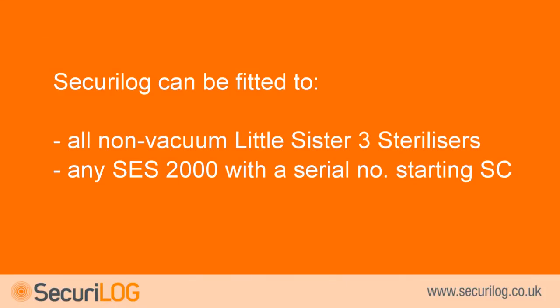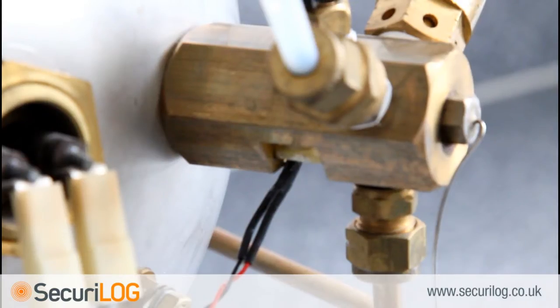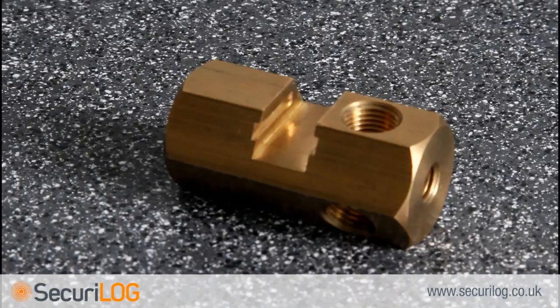Secure log can be fitted to all non-vacuum Little Sister 3 sterilisers, and any SES-2000 with a serial number starting SC. Secure log can also be fitted to the SES-2000 with a serial number starting SED; however, you will need to make sure that the manifold at the back of the chamber is the slotted version shown here, rather than the older manifold where the sensor is placed into a hole.